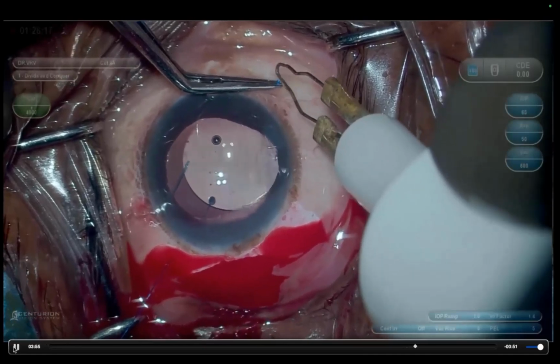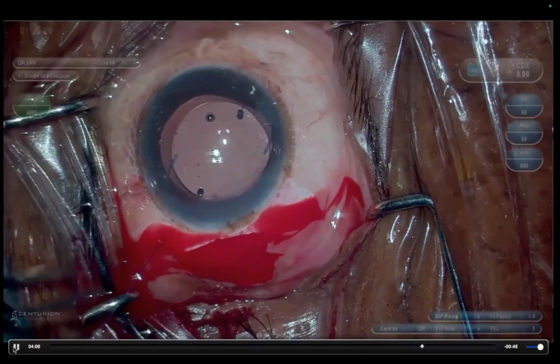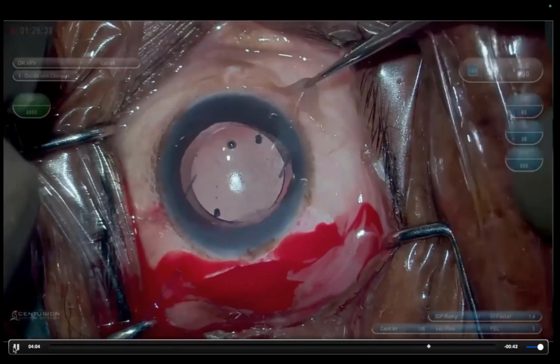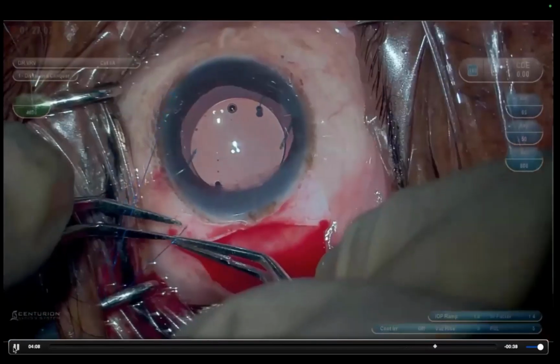So make sure you don't touch the suture when you're flanging because if you touch the suture, you're going to have sharp ends. So to bury it below the tenons and conjunctiva, you pull the suture on the opposite side while simultaneously lifting the conjunctiva tenons.